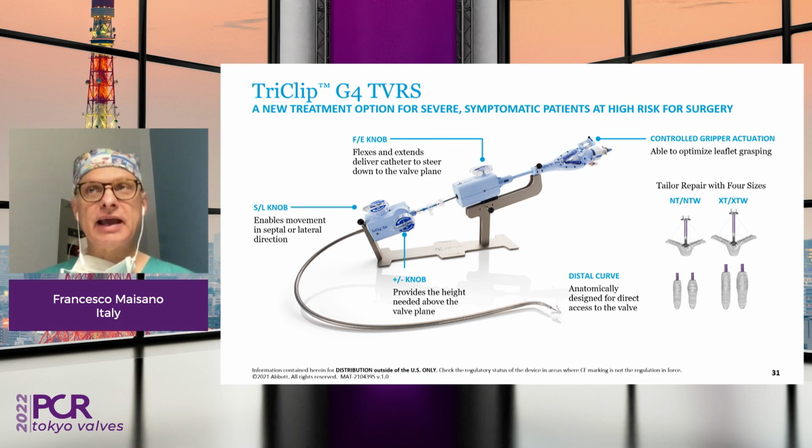So it is actually much more difficult to find the ideal spot for the clip implantation. And for this reason, you need a very reliable delivery system, which is very solid and very reliable in bringing you exactly where you want. Actually, I suggest everybody not only to work on coaxiality, but also to stop ventilation as you cross the leaflets to enhance precision.